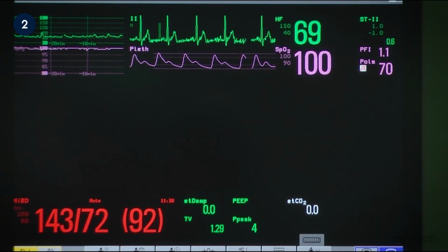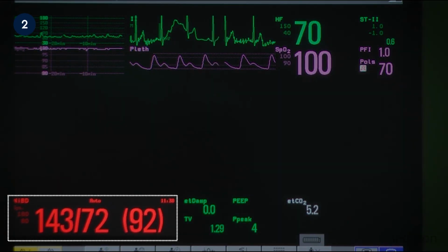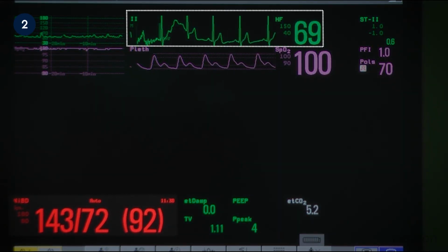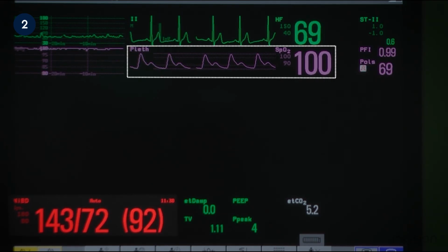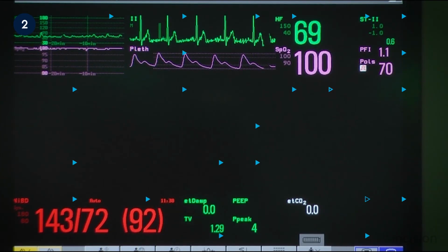In the first 5 to 15 minutes of a spinal block, monitoring is essential. In this period, each of the previously mentioned parameters should be checked every 5 minutes to ensure the patient has not developed a high or total spinal anesthetic.